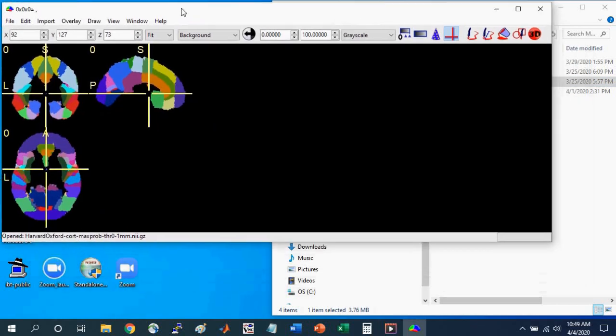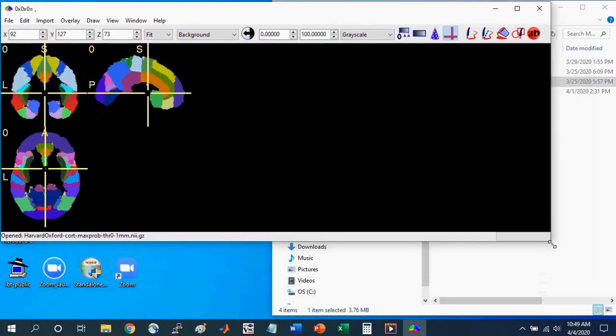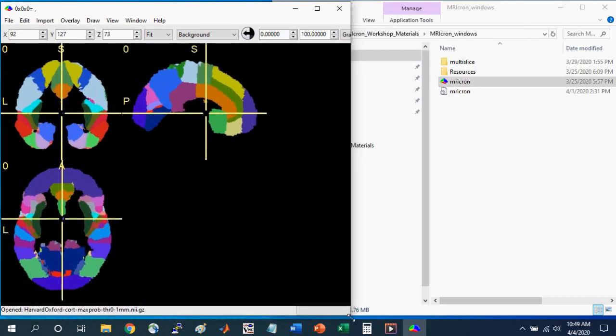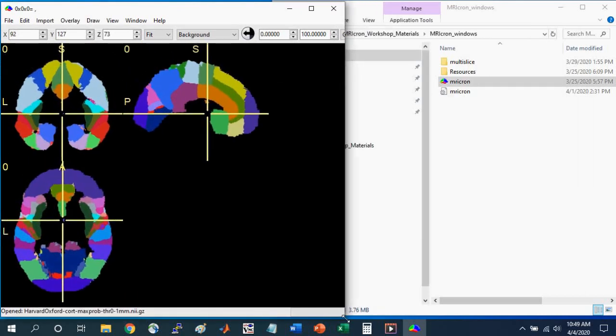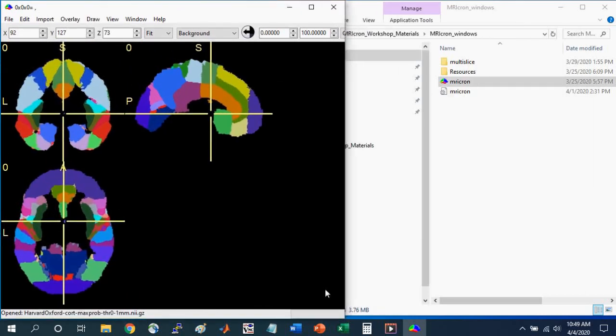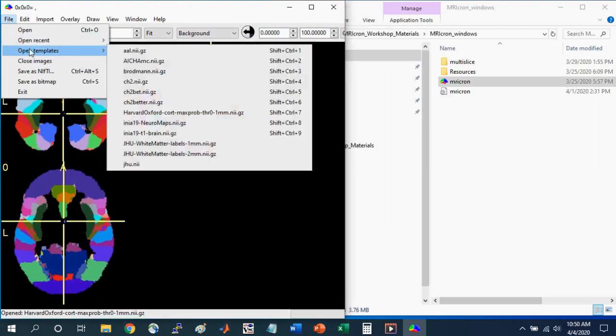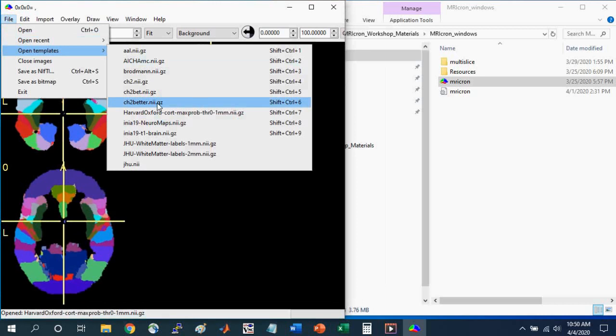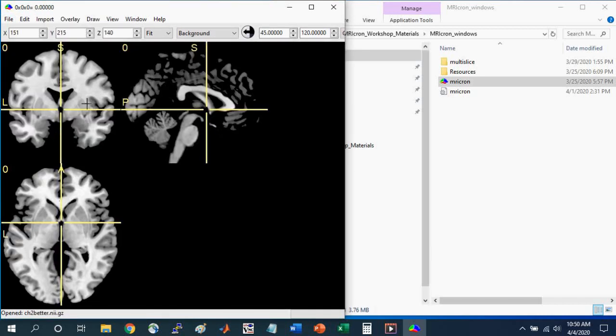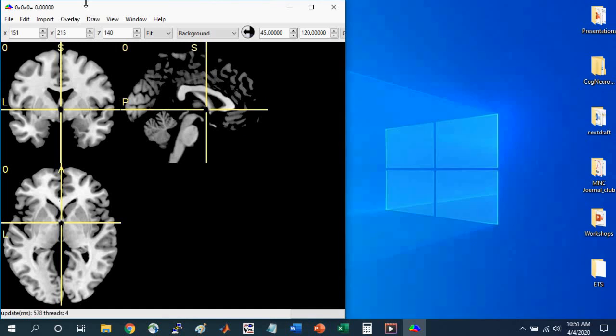This is opening a brain file that I had loaded when I had previously closed MRI-Cron, and so I'm going to first open a template brain. So I'm going to go to File, Open Templates, and select CH2 Better. This is the standard brain in MNI space that can be used to overlay different anatomical atlases or statistical maps. See the introduction to brain navigation with MRI-Cron tutorial to learn how to get the settings that I have here and learn what these different parameters mean.